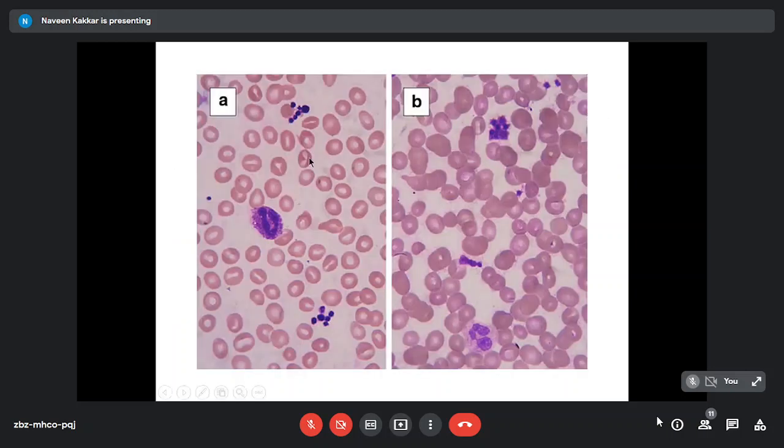So that is the citrate sample and that's a heparin sample. If you see again, the platelet clumps are persisting, but there is no phagocytosis or satellitism anymore. And just to see, the citrate one is more clear. The heparin slide will give you a fuzz or the staining of the plasma. So it's a very different kind of staining that you can pick up once you see a slide consistently stained with heparin, at least in these cases.